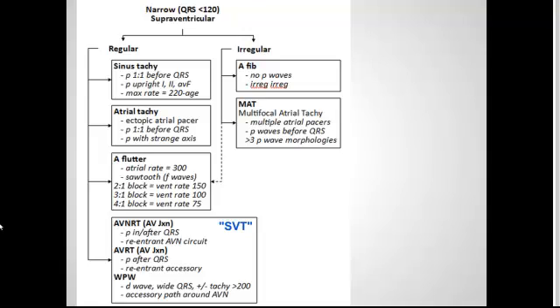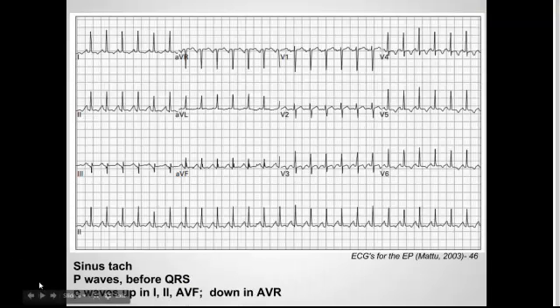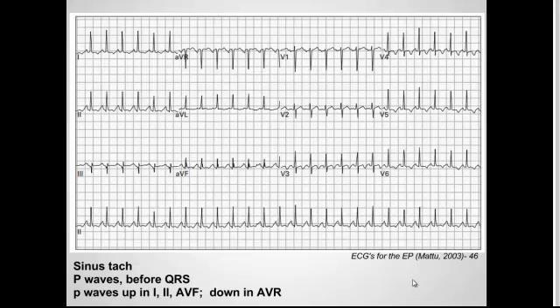Let's start with sinus tachycardia — I have all the answers at the bottom, but you can try to find each characteristic in the EKG above. You're going to first look for a narrow complex that's regular. Next, look at the P waves: we do see a P wave before every QRS. Another thing to look at is the axis — the P waves should be upright in leads I, II, and aVF, and down in aVR. So here it's up in I, II, and aVF and down in aVR.